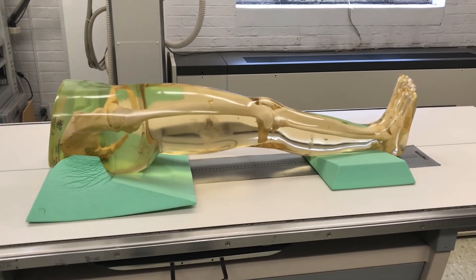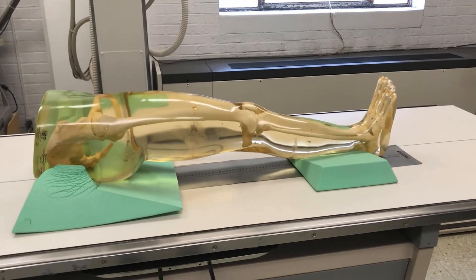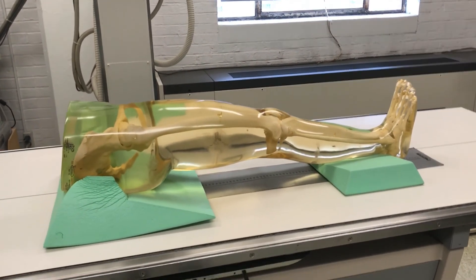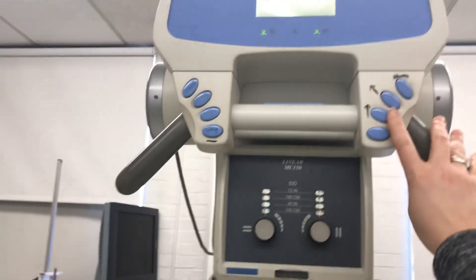You're gonna do these exposures in the bucky. We're gonna make three exposures — one at the hip, one at the knee, and one at the ankle. These are really small, coned-in tight exposures just at the joint space.